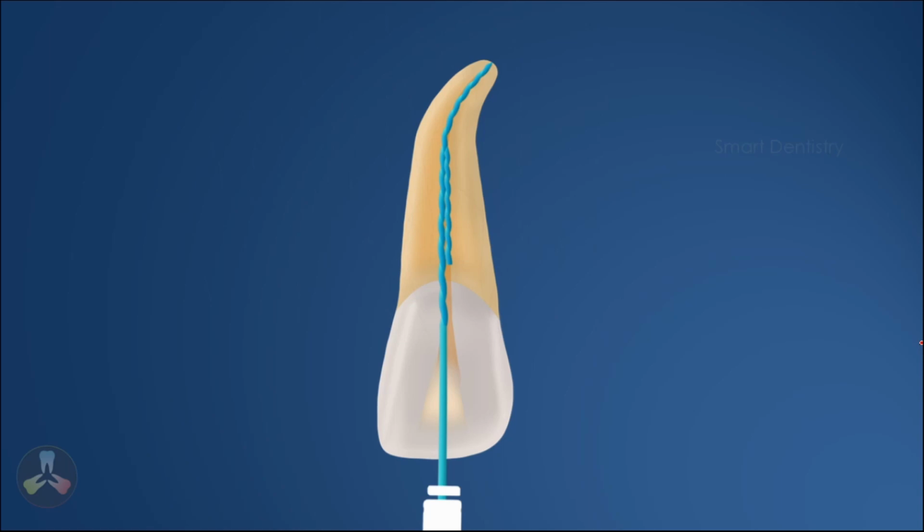So removing the file and bypassing the file and doing a good obturation, even though there is a file separation, the success rate is not compromised. There is a technique which is commonly practiced by endodontists for removal of the fractured file.